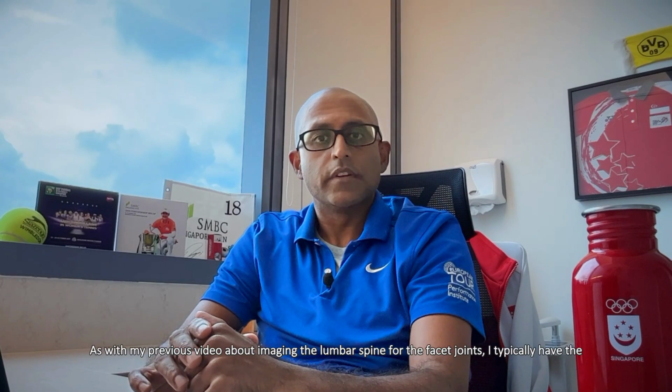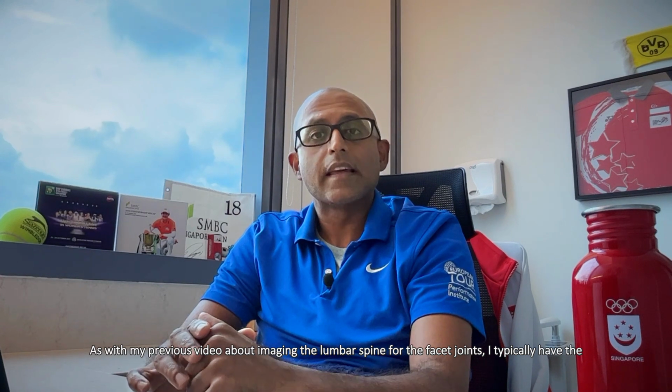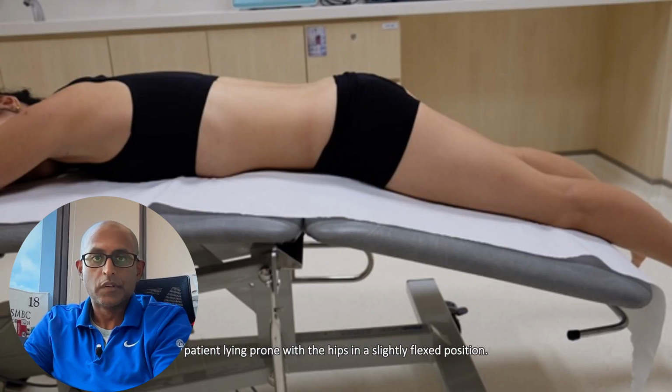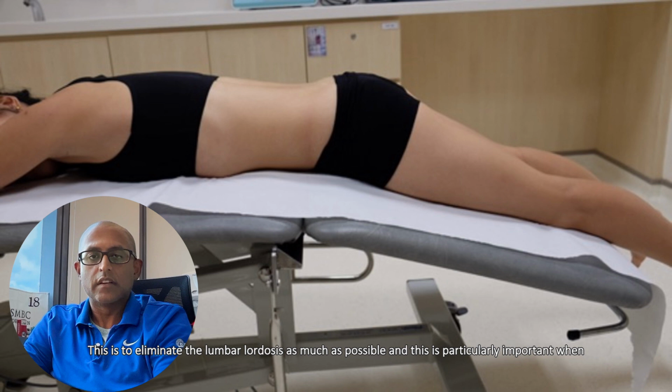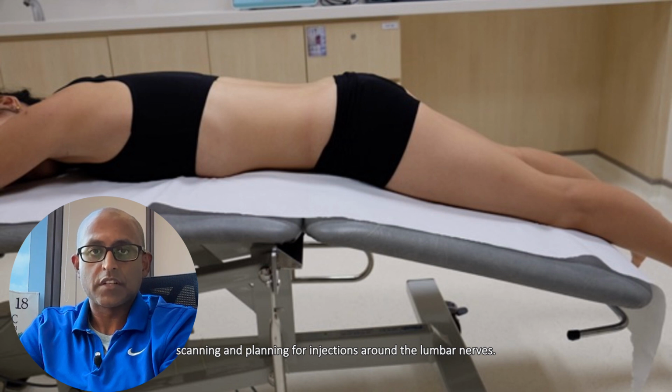As with my previous video about imaging the lumbar spine for the facet joints, I typically have the patient lying prone with the hips in a slightly flexed position. This is to eliminate the lumbar lordosis as much as possible, and this is particularly important when scanning and planning for injections around the lumbar nerves.